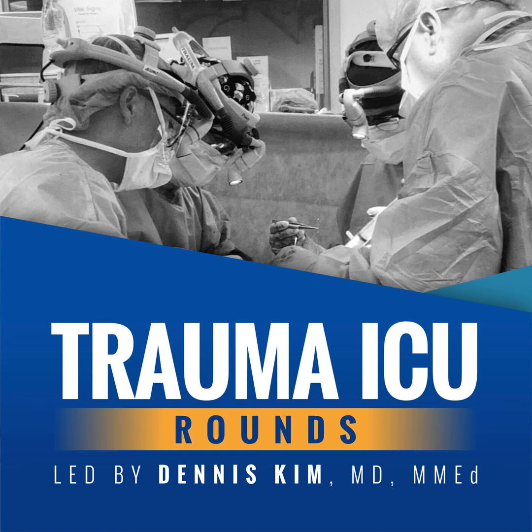The third factor to consider when we're discussing a mode of ventilation is the timing of breath delivery. And in my mind, when I think about the timing of breath delivery, there's really three general techniques. If you look at the front of the ventilator screen and look at all the acronyms when you go into the different modes, there's really three common or basic breath delivery techniques. And they are continuous mandatory ventilation, or CMV, synchronized intermittent mandatory ventilation, or SIMV, and spontaneous modes. So in the next episode, as we get into the different types or modes of ventilation, we'll talk a little bit more about this.